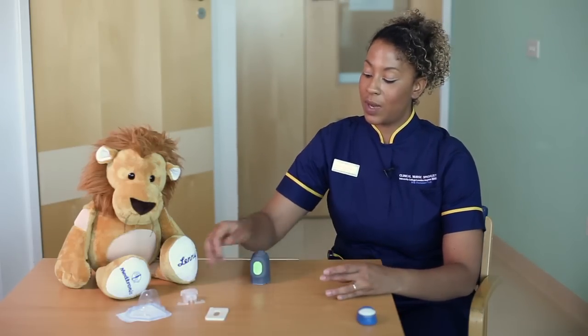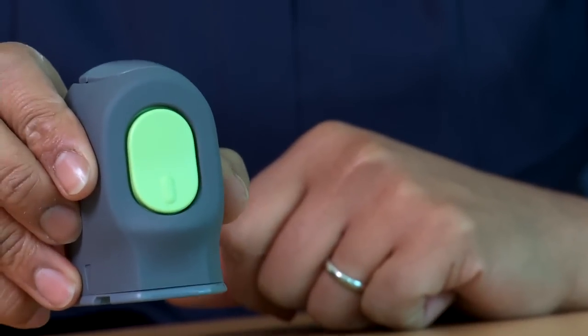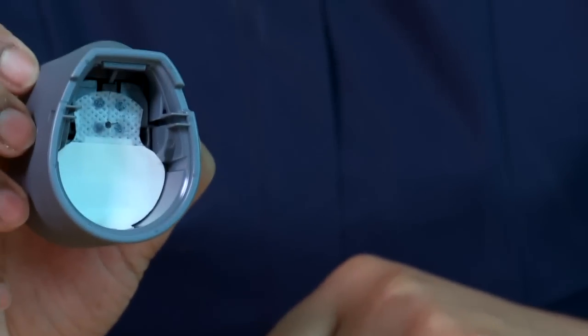The packaging can go away. If you don't want your child to see the needle, just don't show them the inside.